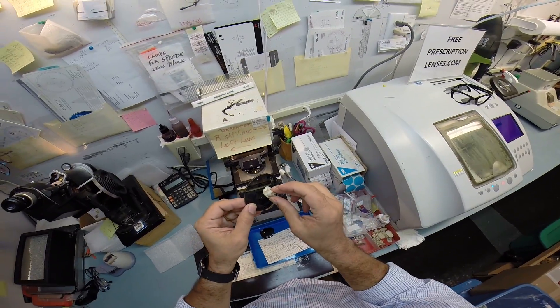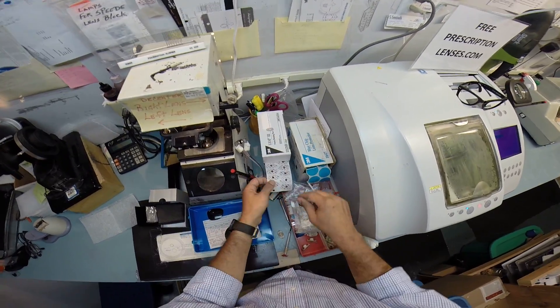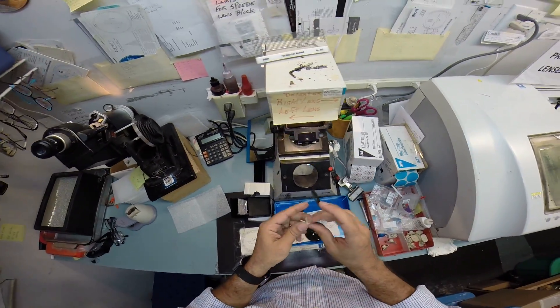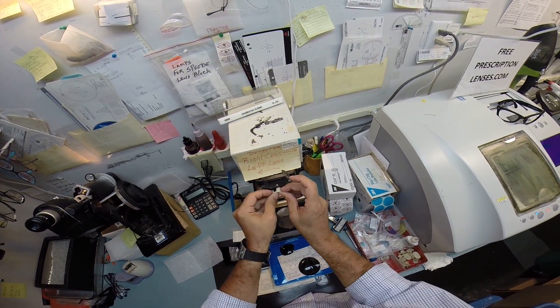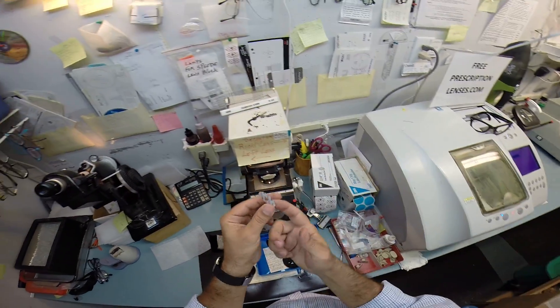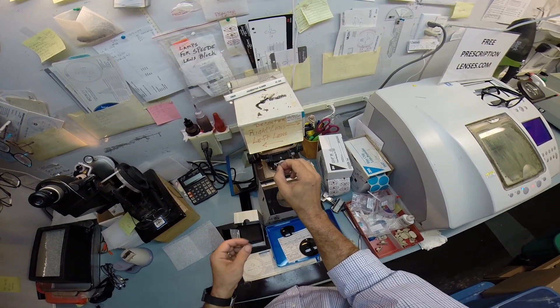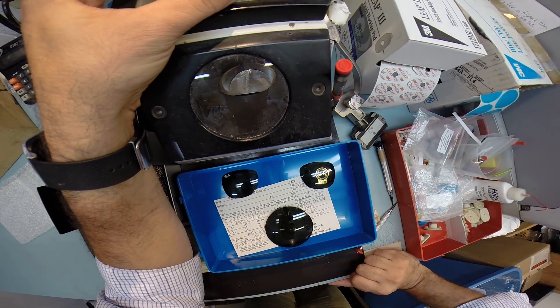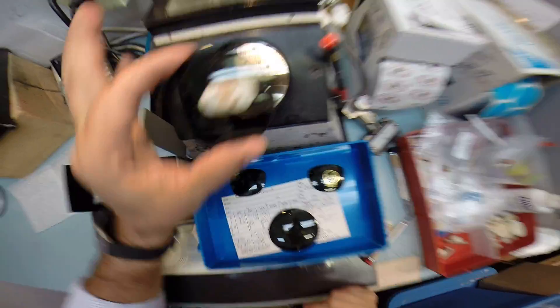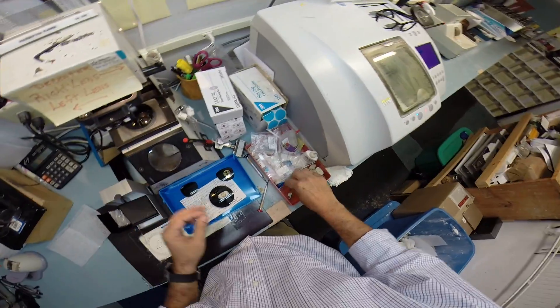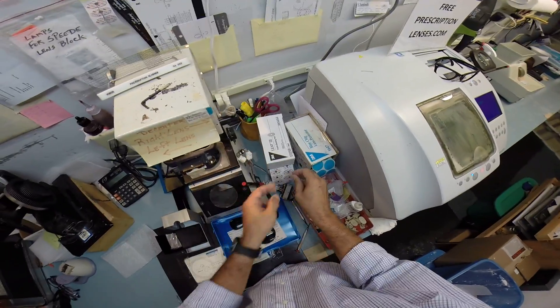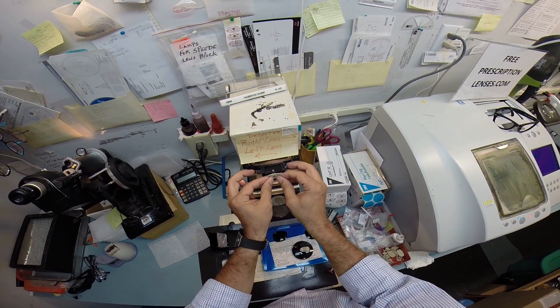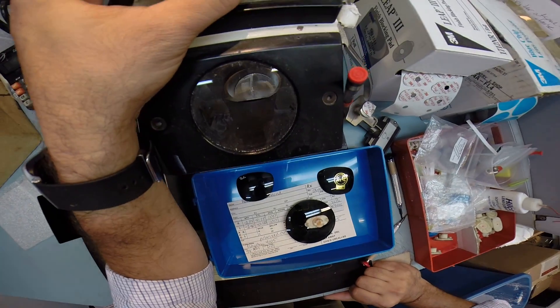This block is what's going to hold it in place while it is cutting. So I need to put a double-sided adhesive sticker. And wouldn't you know, 3M, the same people who make Post-it notes, make some double-sided adhesive stickers. The black side is the sticky side. So I'm going to stick that onto the block. Pull the tape away to make both sides sticky. Get everything lined up. And essentially what I'm doing is I have a crosshairs of a scope. So let's do that again with your left lens.